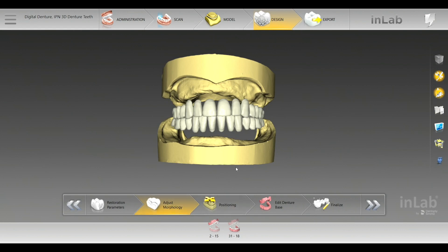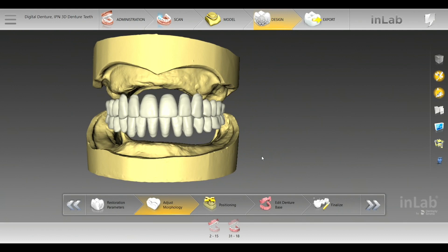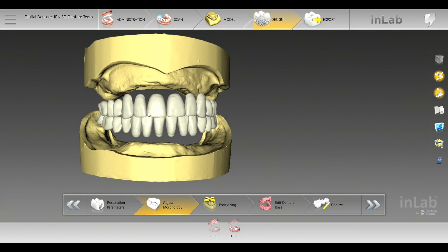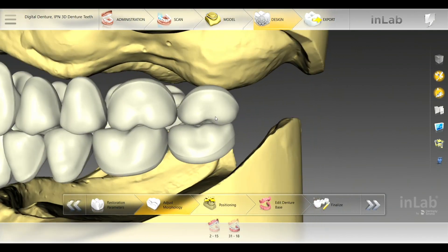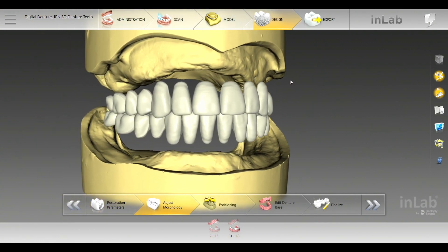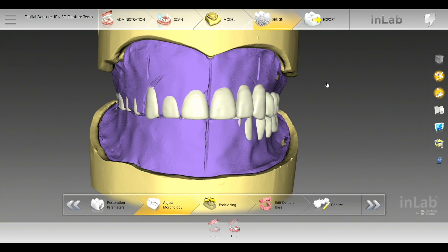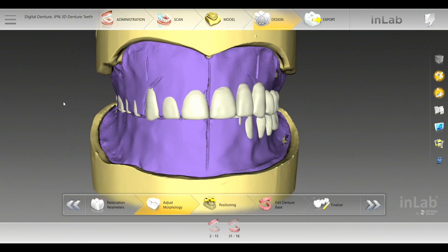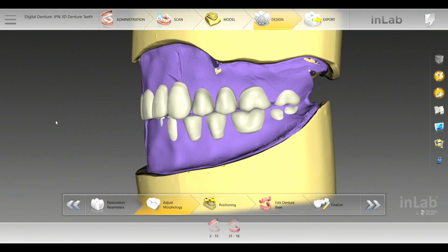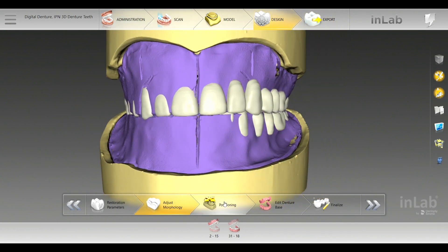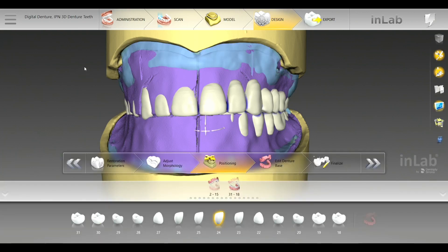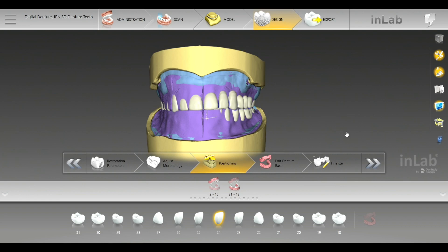Here we're in adjust morphology. We can't do too much in this aspect except change your tooth mold. Let's say you didn't think the IPN 3D portrait was right — you'll actually have interproximal spaces and you'll be able to tell, 'Hey, maybe I need to choose a longer mold.' That's why the bite registration is so key — pulling that up, you're able to see everything that you need. So let's go ahead into the positioning phase, since we can't really go into the biogeneric — that's more or less for single printed arches.